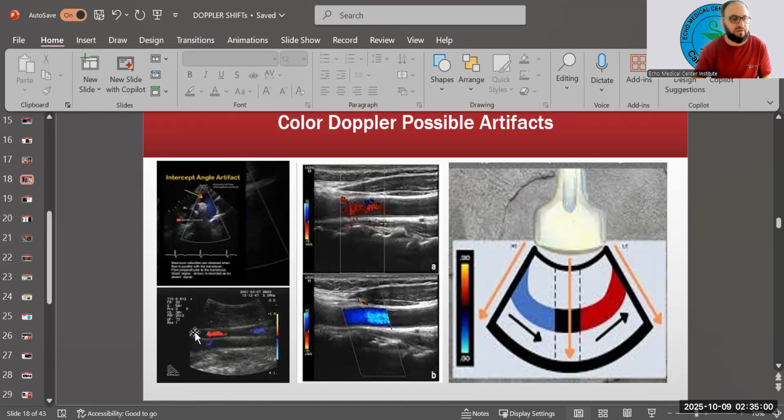Here it's away, and here it's towards. You see the flow, and it disappears and then appears again. It looks like this area is more than 90 degree, maybe 95, 100 somehow. So the flow is going away. Here the angulation is maybe 85, 80, 82, 80 something, 89 even, but not 90. When it becomes 90, everything is gone.